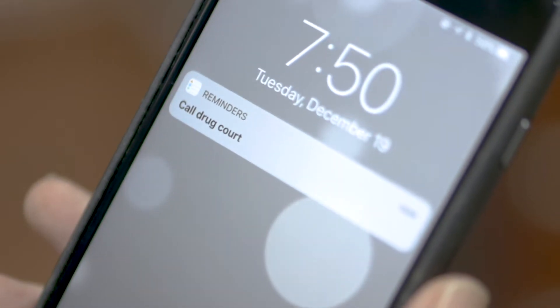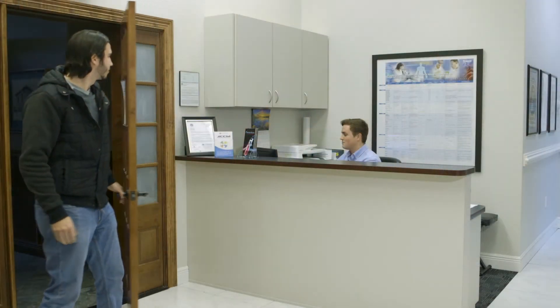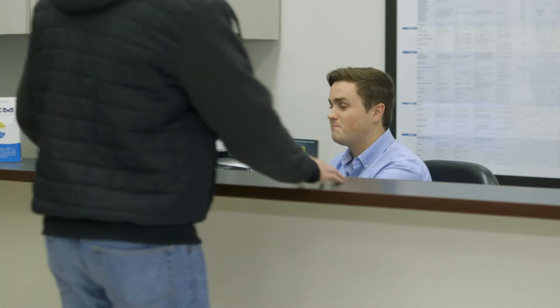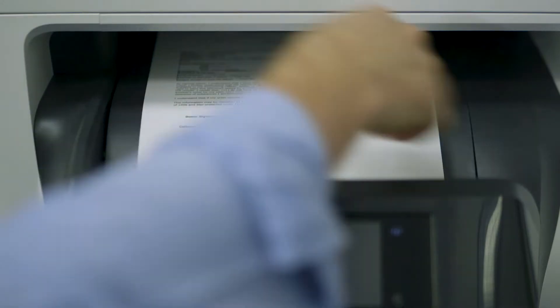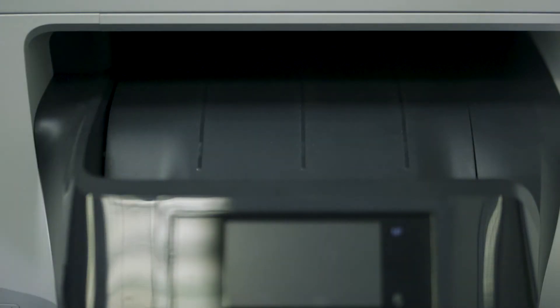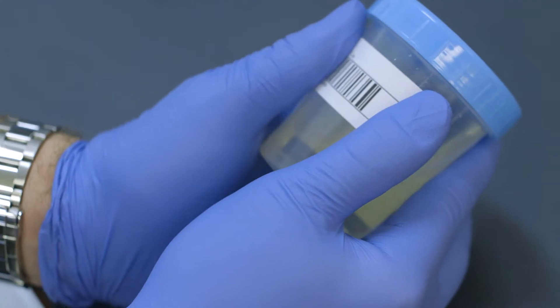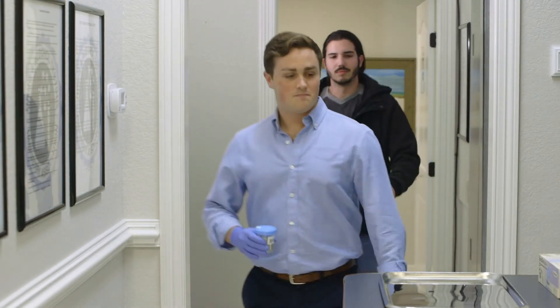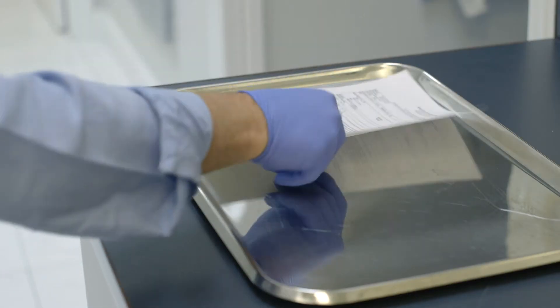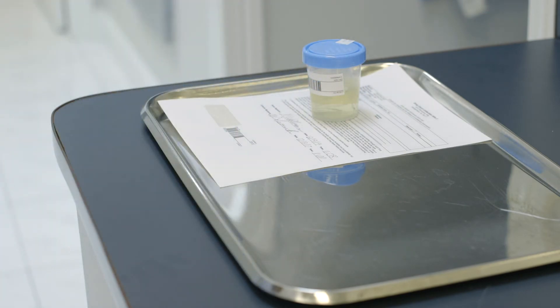A laboratory software system such as the Paracelsus software schedules randomized testing and tracks participant attendance during the entire course of their program. The chain of custody form has adhesive barcodes that are peeled off and placed on the specimen cup. After a watched specimen collection, the cup is sealed by the collector and information is verified on the chain of custody form.